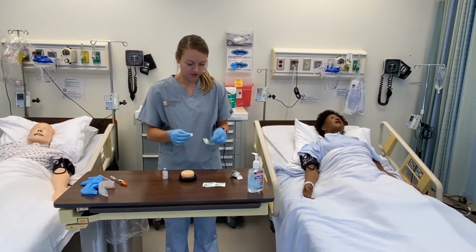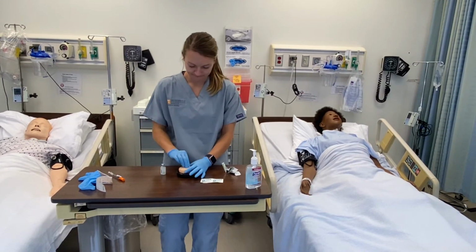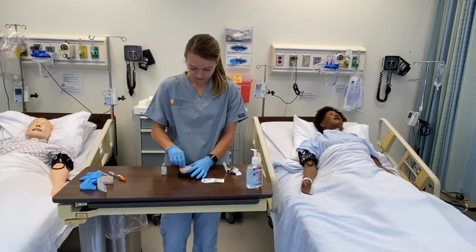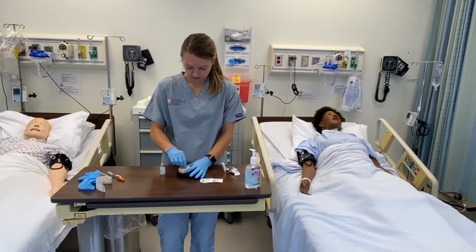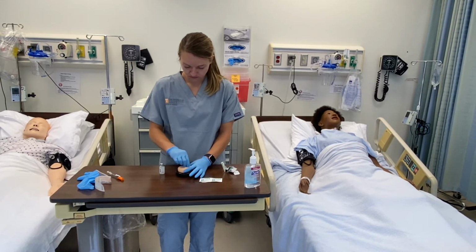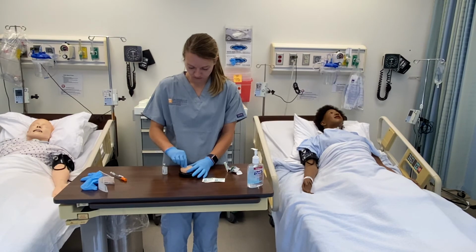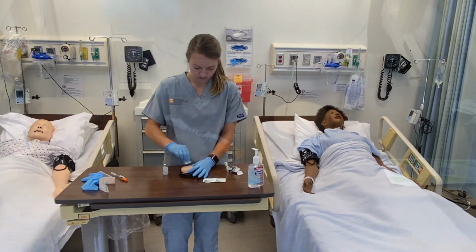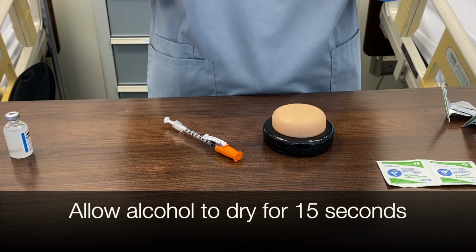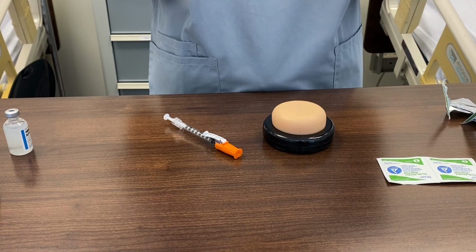I'm going to give you your insulin on the back of your right arm today. Allow alcohol to air dry for at least 15 seconds without exposing the site to contamination.